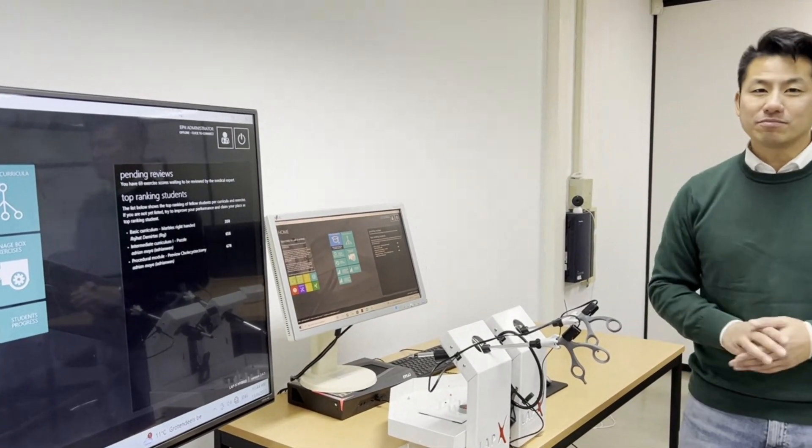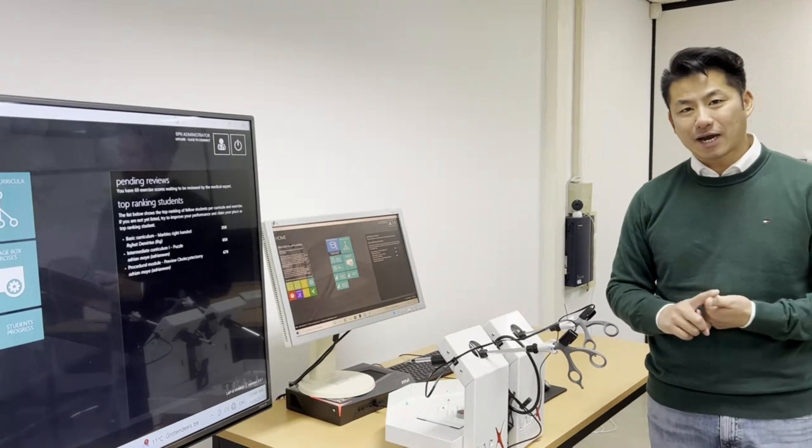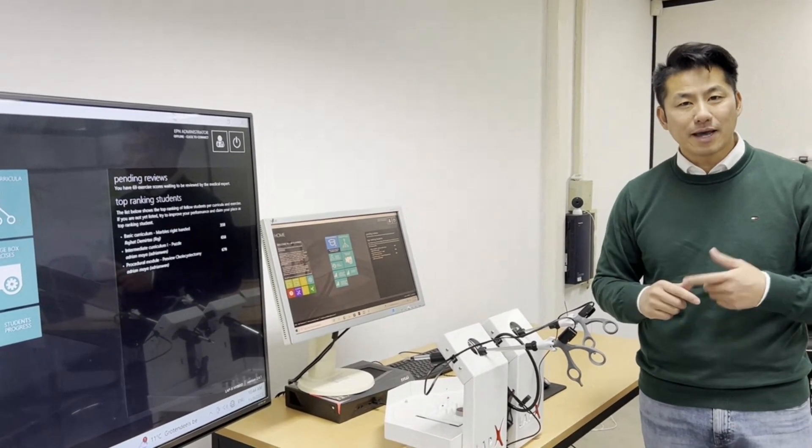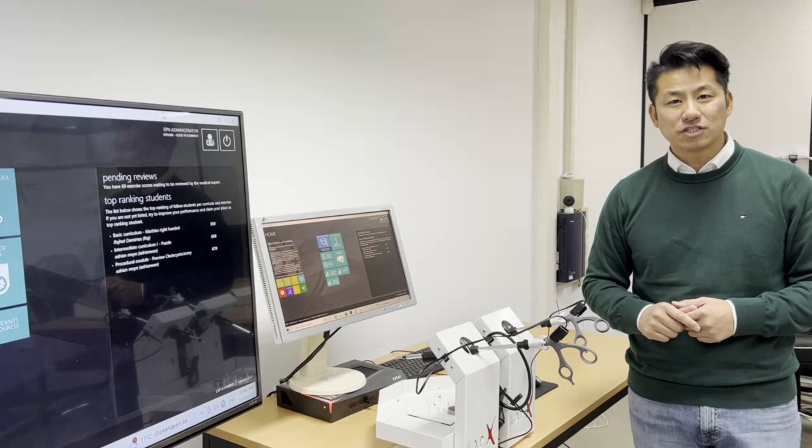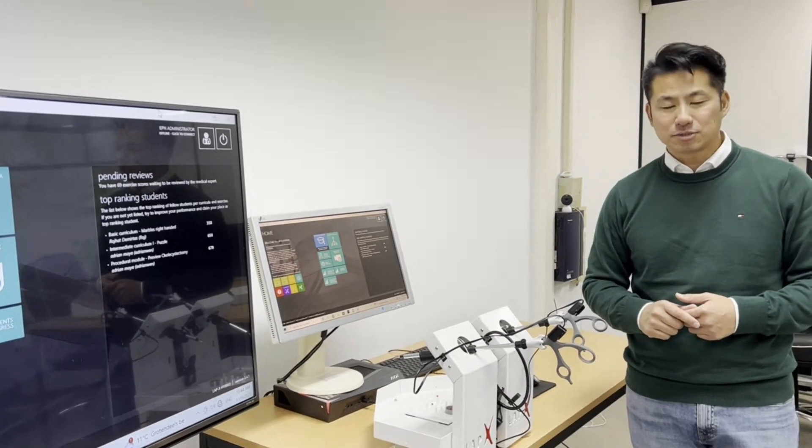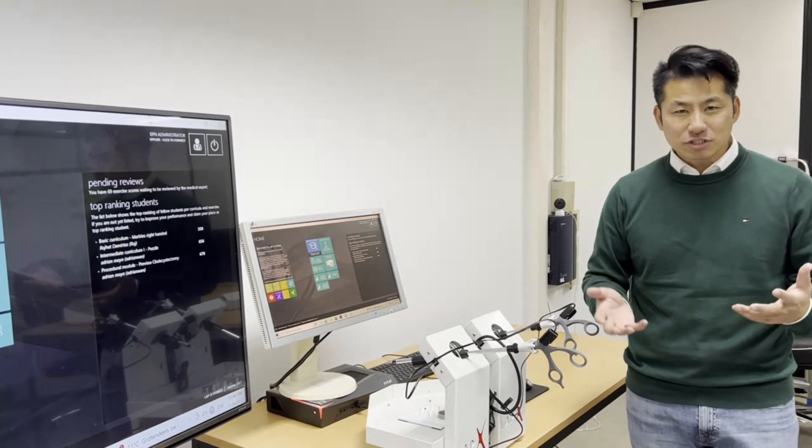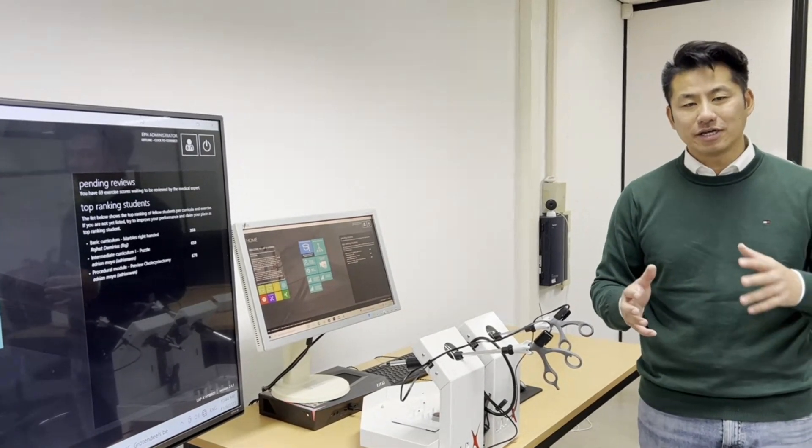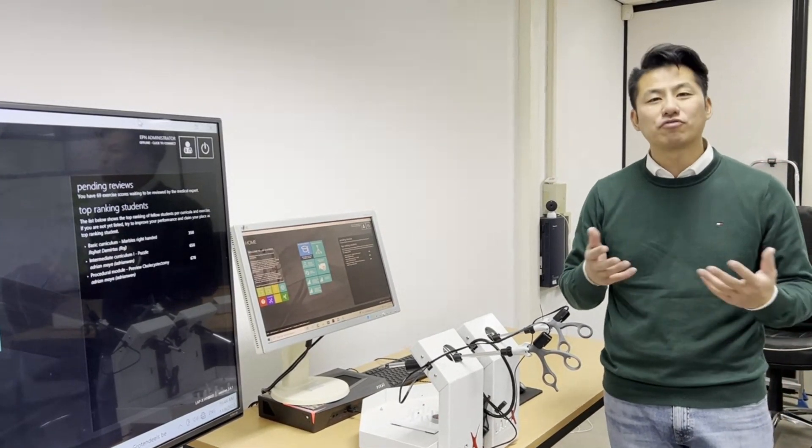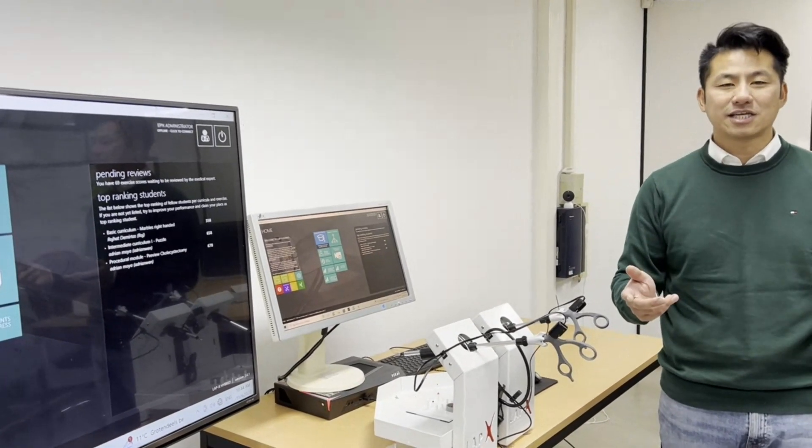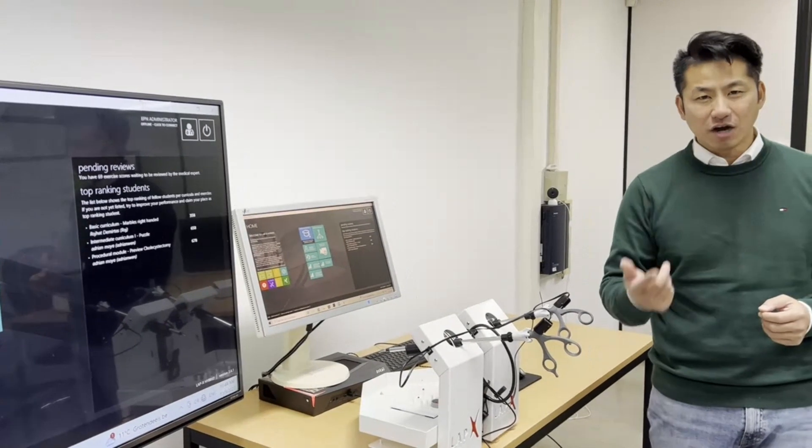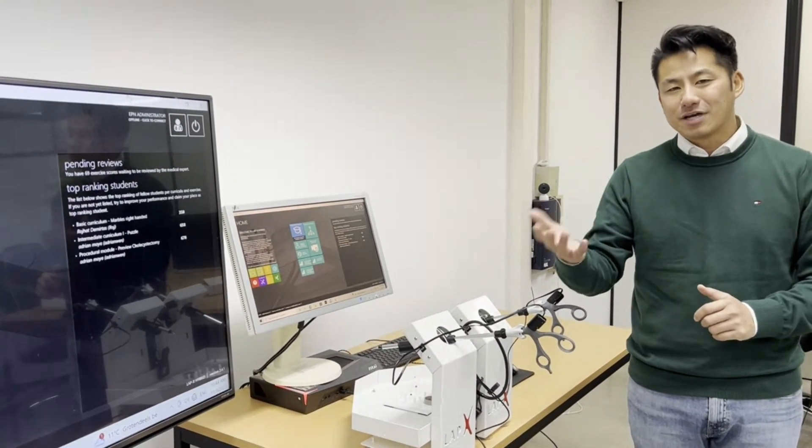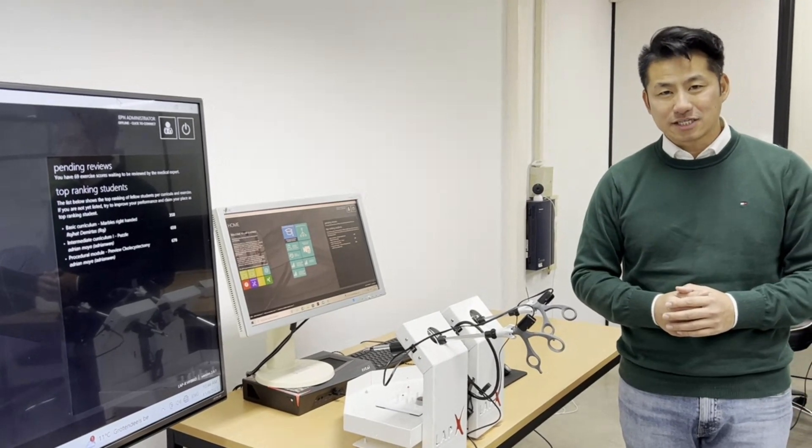Now we have three different models of LAP X. We have the LAP X Hybrid which is this one. We also have a LAP X VR which stands for virtual reality and we have a LAP X Box. The big difference between the three is the LAP X Hybrid is a combination where you can train both virtual reality exercises as well as box training exercises. Where the LAP X VR you can only train the VR exercises and the LAP X Box, the box exercises.